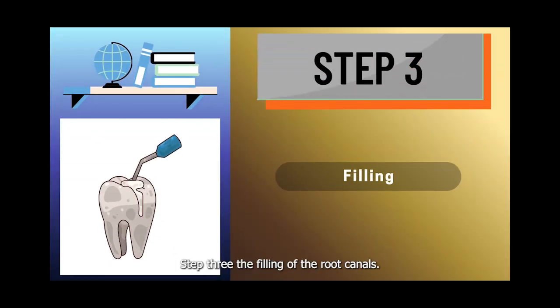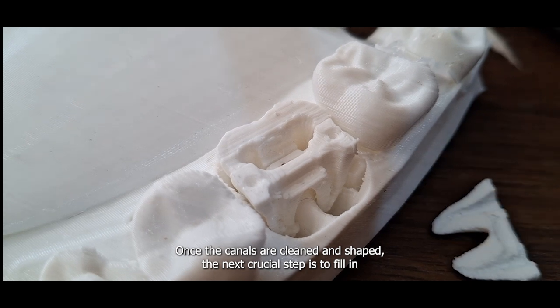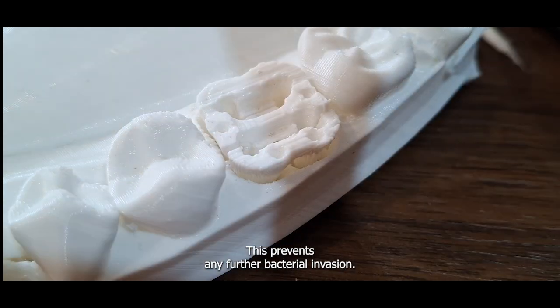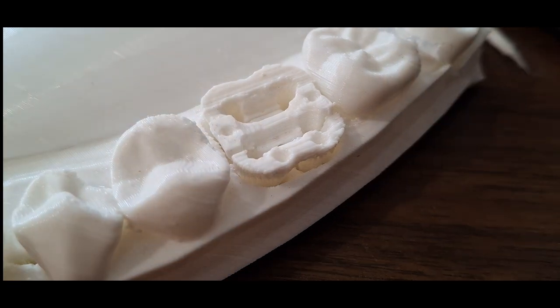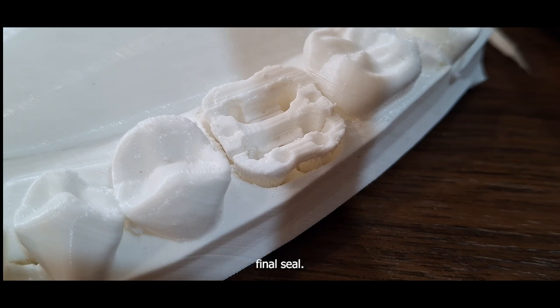Step 3, the filling of the root canals. Once the canals are cleaned and shaped, the next crucial step is to fill and seal them. This prevents any further bacterial invasion. We might use medications like clindamycin hydrochloride or a steroid combination with calcium hydroxide inside the canal to ensure it's completely disinfected before the final seal.